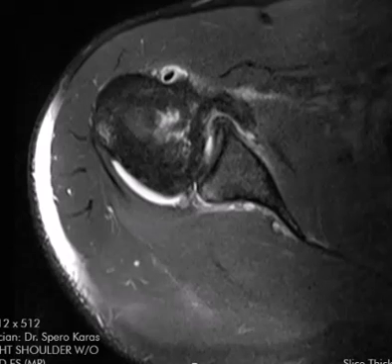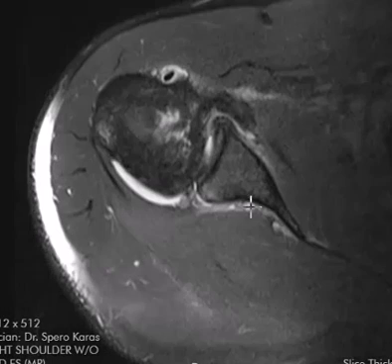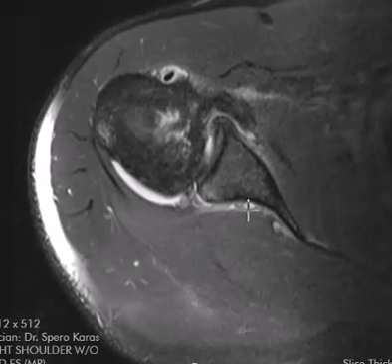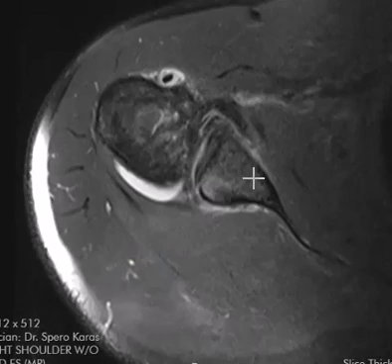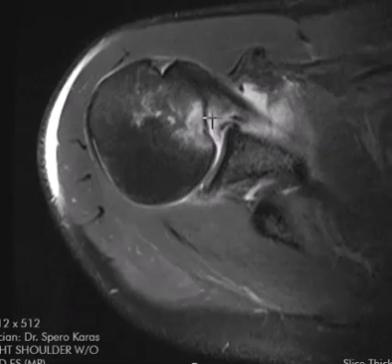Hello, this is Dr. Gay from First Look MRI. This is a 47-year-old male with a history of recent injury. They didn't say how he was injured, but he has a significant bony injury in the anterior humerus here.